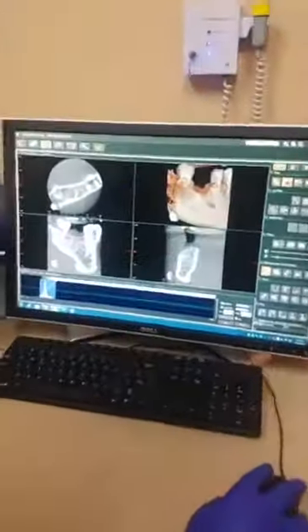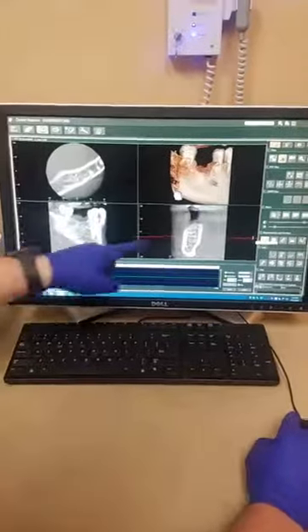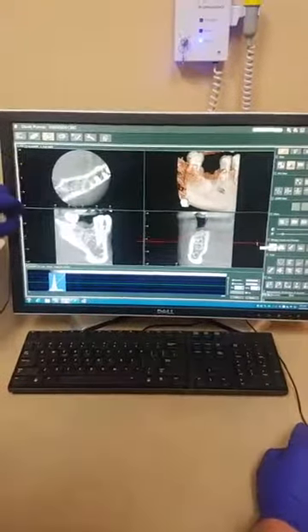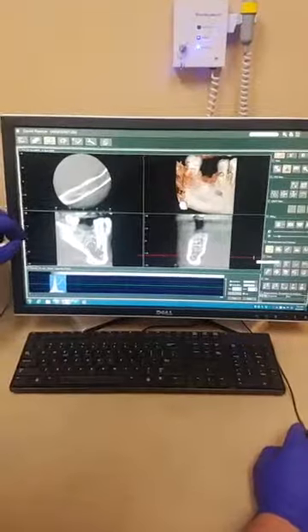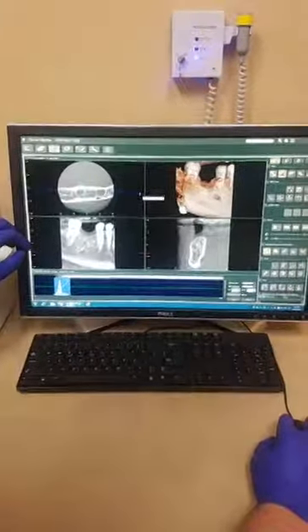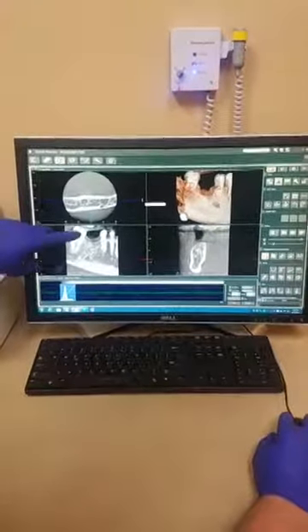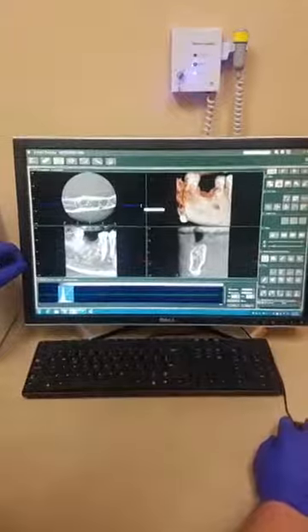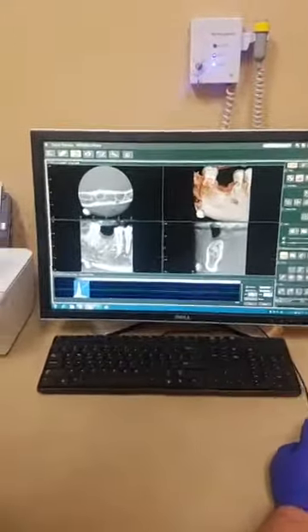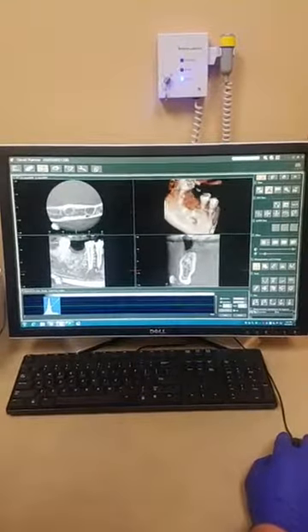So if you take a look here, just to make sure that it's really apparent, if I use this red line, I'm going through David's top of the tooth all the way down, looking at the bone and looking for the anatomy of where David's nerves are, to make sure that when the implant is placed, it's not placed on a nerve in that area, and also so that we see the width that David has available for the specific size of the implant, or how big we can make the implant there as well. And then here's that video that I showed you before of David's mouth.